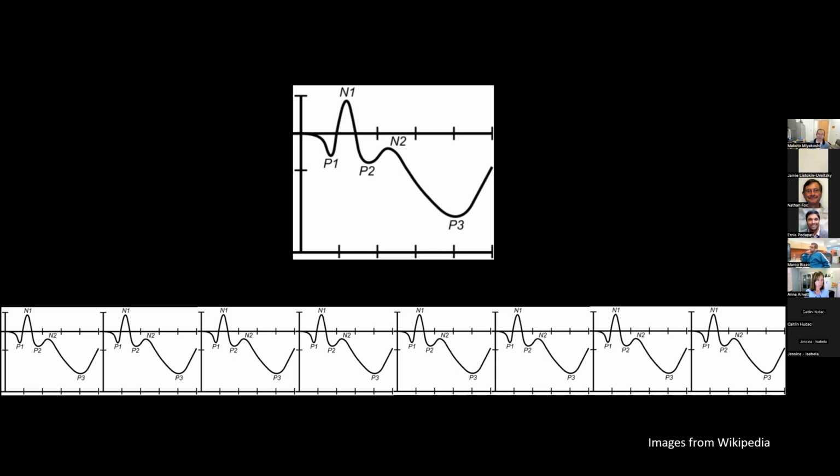So the definition of stationarity actually depends on the time scale, right? So that's why it's a bit confusing. It's not like averaging, which should be done in this way. No one makes a mistake in taking the average because it's so simple and understandable. But with the definition of stationarity, it's like, okay, stationarity in what time scale? Are you talking about minutes, seconds, hours, or milliseconds? So this is why the concept of stationarity is not very popular and not very much used in an explicit way in calculation. But stationarity is still a very, very important assumption and concept in pre-processing EEG.